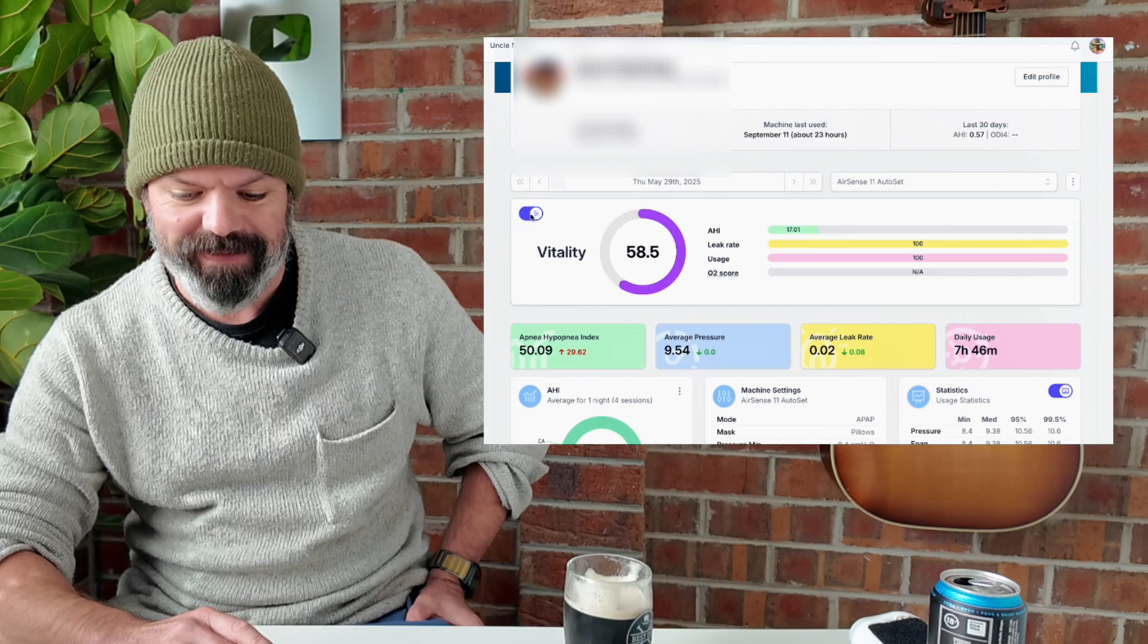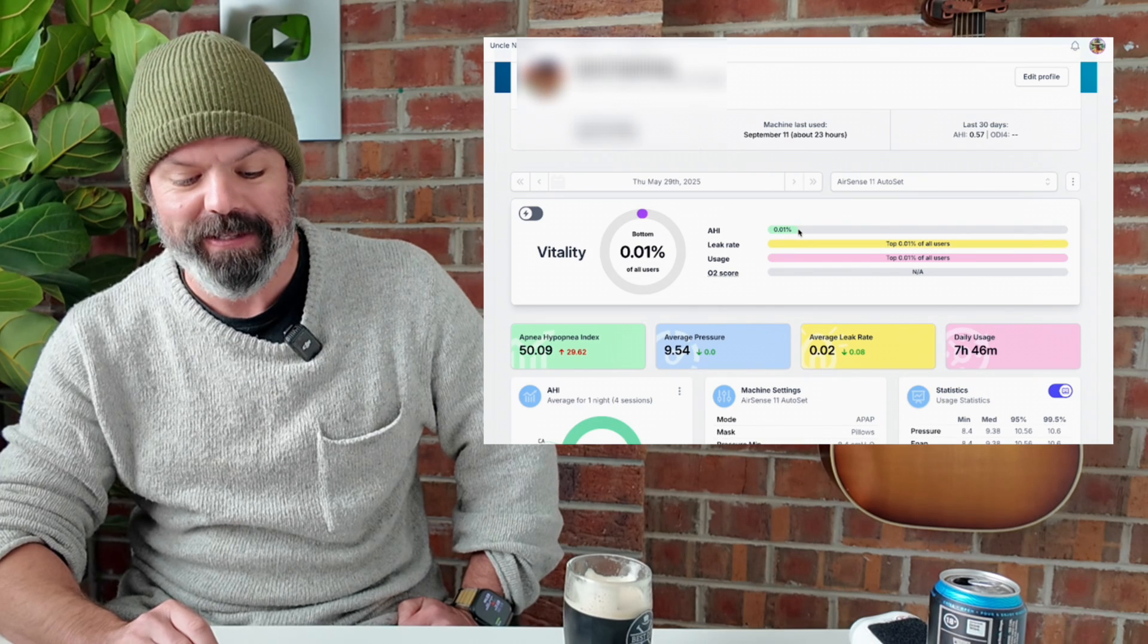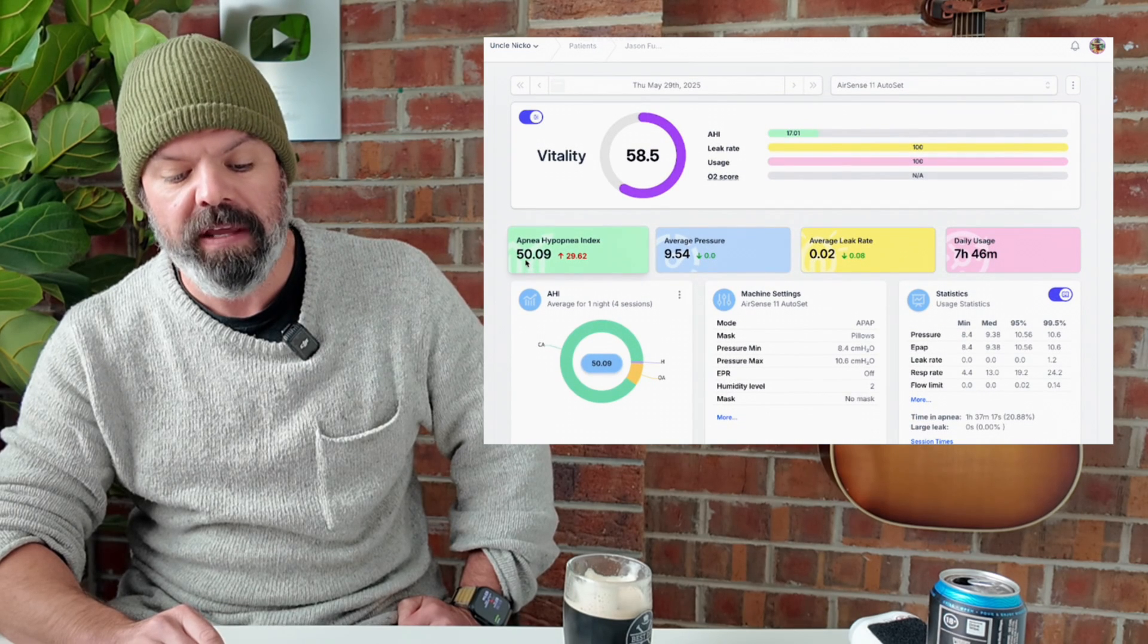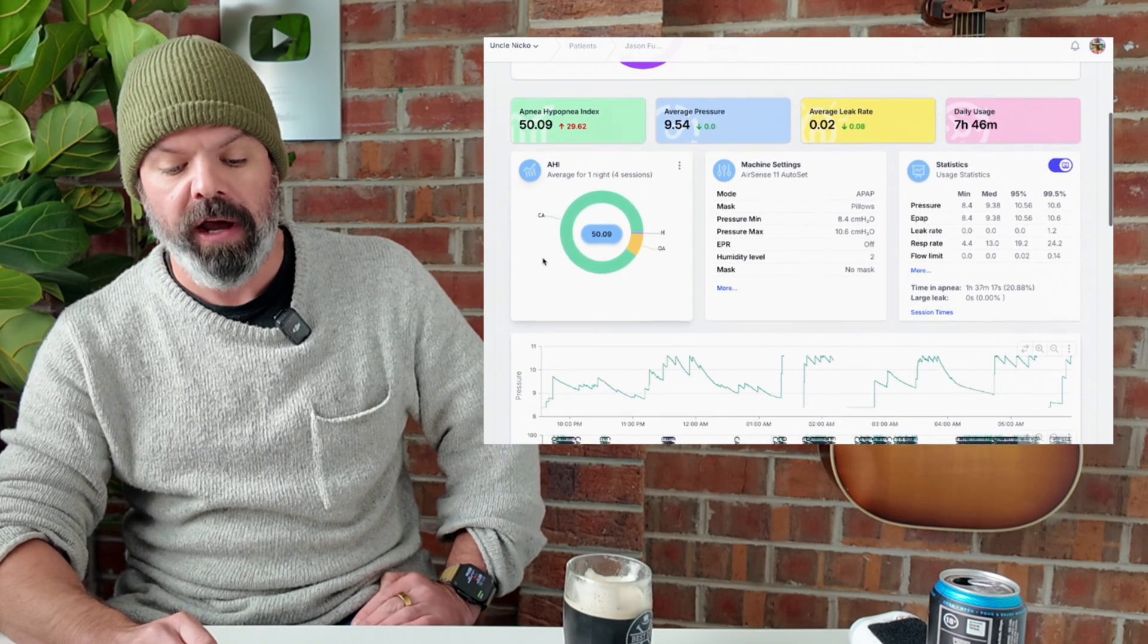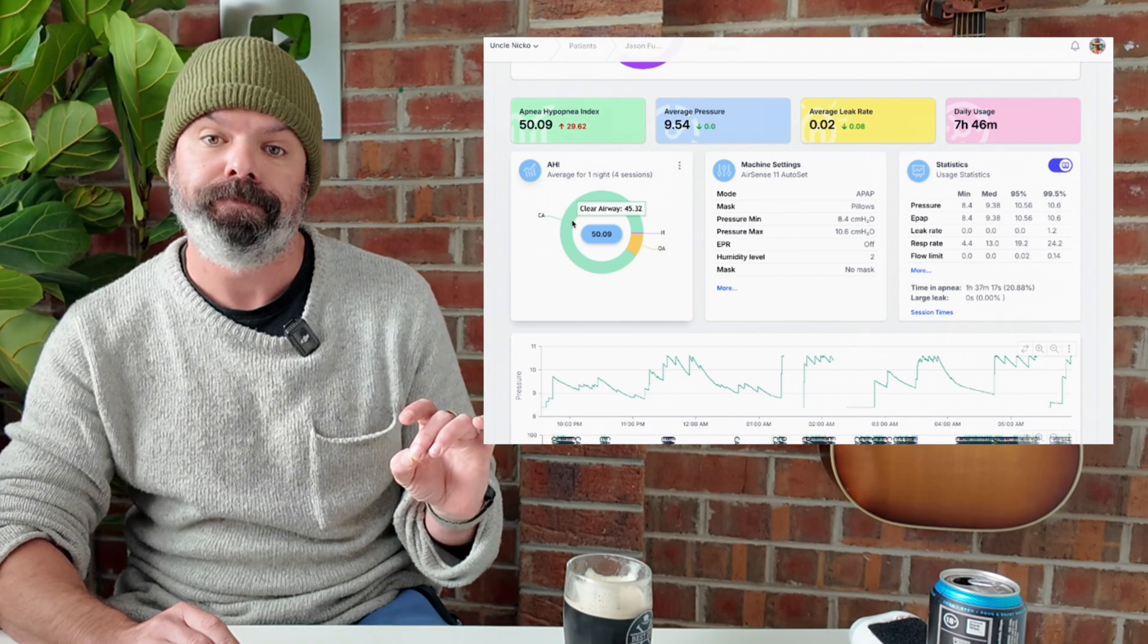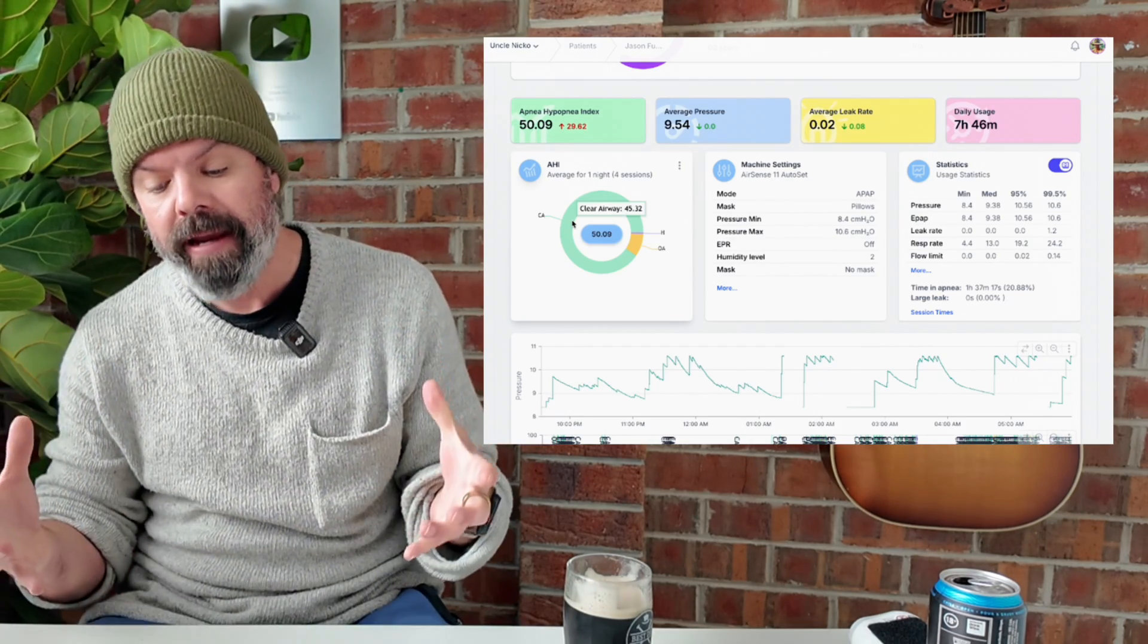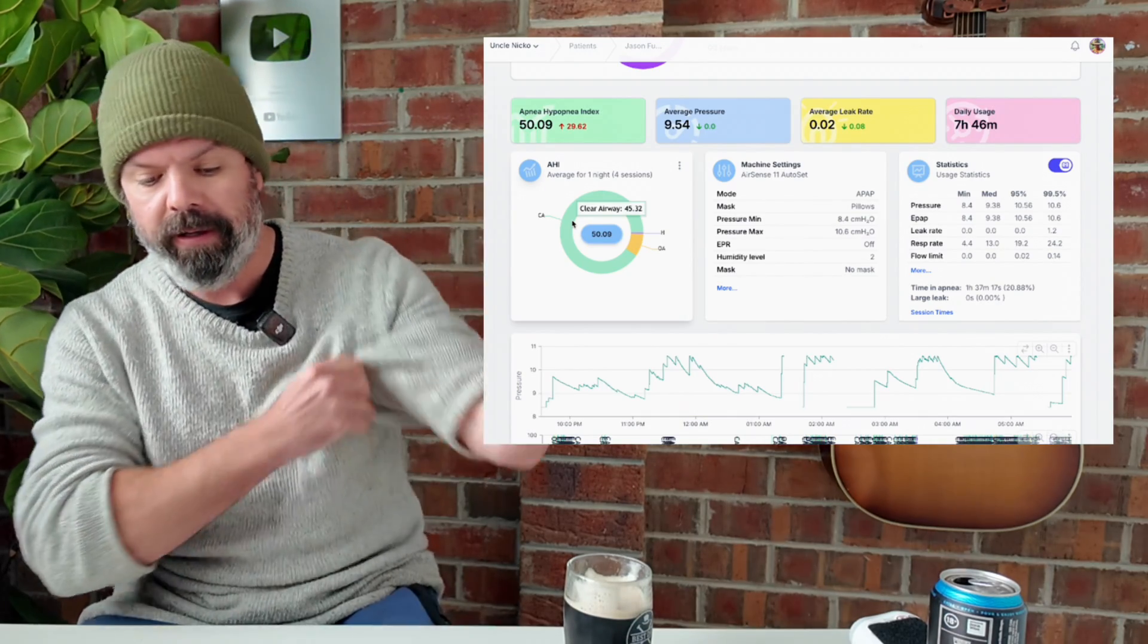And all of a sudden, now he's in the bottom 0.01% of all users. However mighty have fallen. And now his apnea hypopnea index is 50.09. Most of this is clear airway. This is central apnea. The airway is not obstructed. The airway is open, but his brain is telling him, hey, stop breathing, stop breathing, stop breathing.